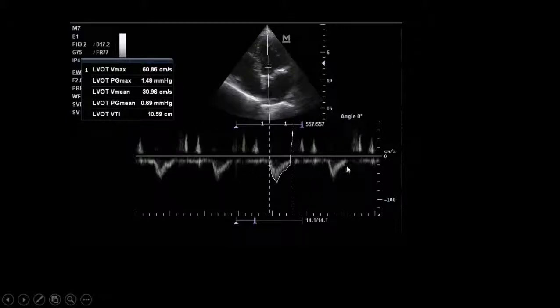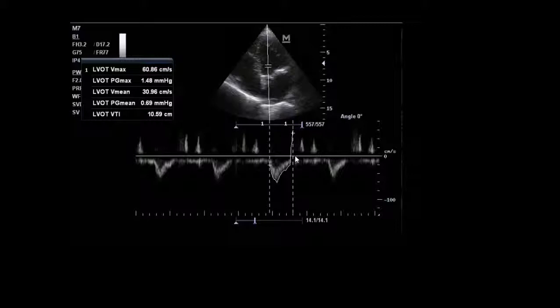During a period of controlled rhythm, we measured the VTI: 10.59cm, which is acceptable. Fitting the pieces together — the patient has ischemic dilated cardiomyopathy, the IVC shows some distensibility possibly suggesting fluid need, but now we can rely on the VTI as there is no arrhythmia at this moment.